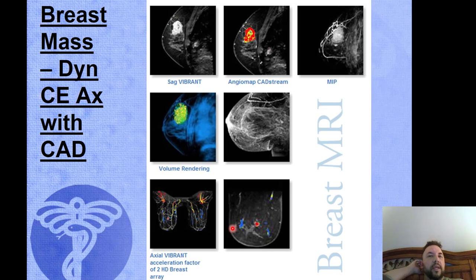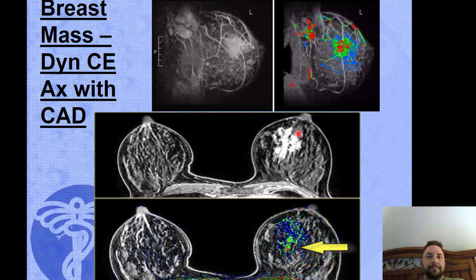And then what would the CAD, the computer aided detection, say about that lesion when we put it into those software mechanisms? You see areas of red, that indicates a hypervascularity. So you have an aggressive malignant component to it as compared to the blues and the greens that don't have as aggressive a blood supply to them. So always red indicates areas of hypervascularity.